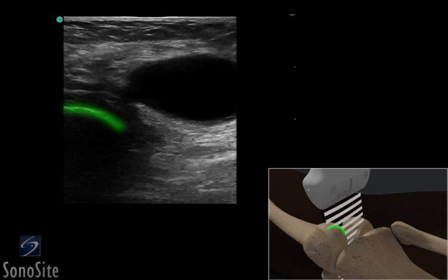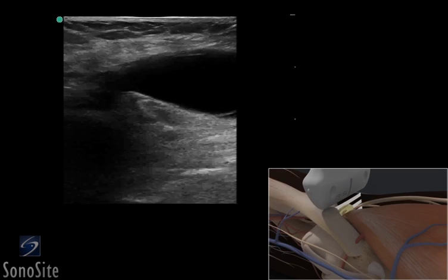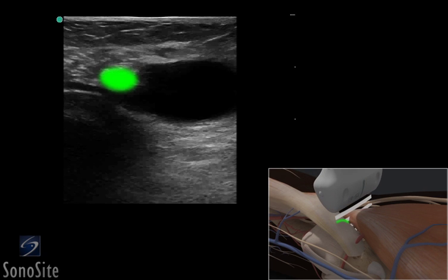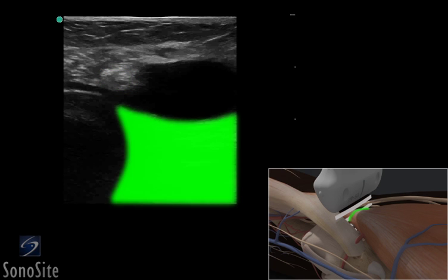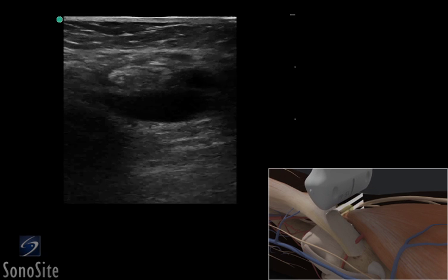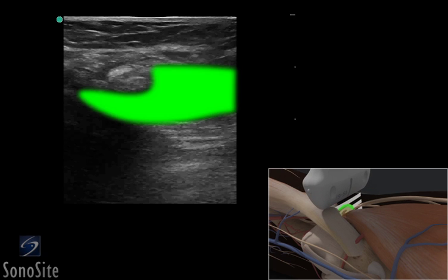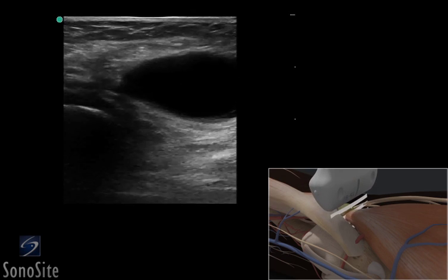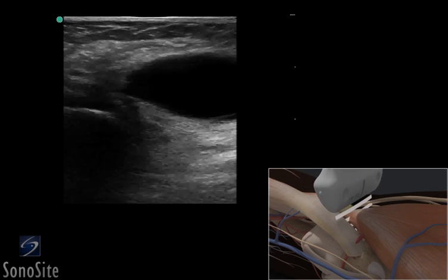The femoral condyle is seen as a bright, hyperechoic structure on the left of the screen. The speckled pattern of the tendon of the semimembranosus muscle and the starry night appearance of the medial head of the gastrocnemius can be seen as the transducer is moved more distally. A Baker's cyst appears as a C-shaped, darker hypoechoic or anechoic cystic structure with a superficial and deep component.